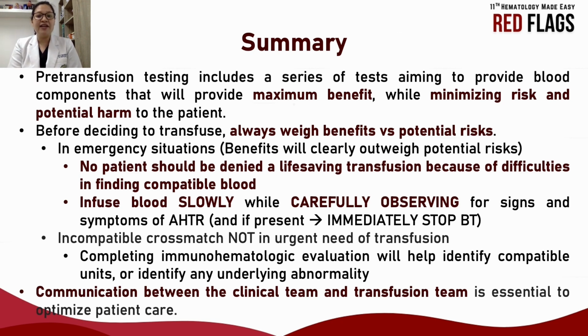For those with an incompatible crossmatch not in need of urgent transfusion, completing immunohematologic evaluation will help identify compatible units and/or identify and eventually treat any underlying abnormality. For these cases, communication between the clinical team and the transfusion team is very essential to optimize patient care.